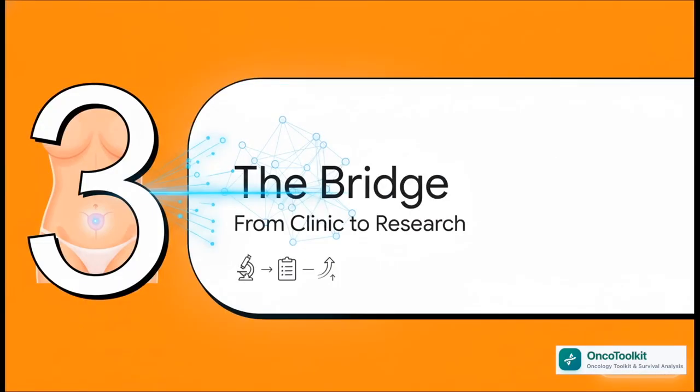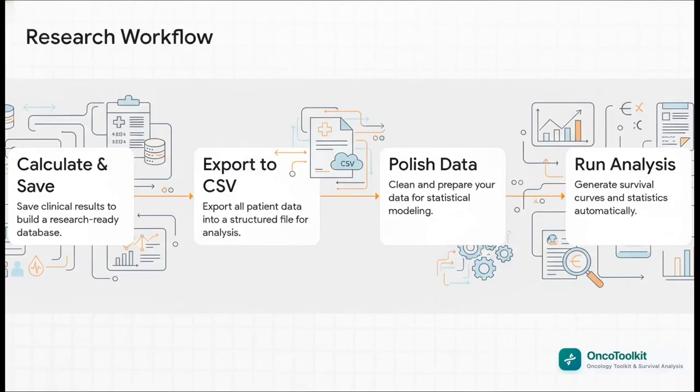But wait, we're not done. The power of this tool goes way beyond just one patient. It's also designed to be a powerful bridge connecting the clinical work you do every day directly to your next big academic research project. And the workflow for this is completely seamless. As you're using the calculator for your patients, you're actually building a powerful research-ready database in the background. From there, you just export all that structured data, clean it up for analysis, and run some pretty sophisticated statistical models, all inside the Oncotoolkit ecosystem.